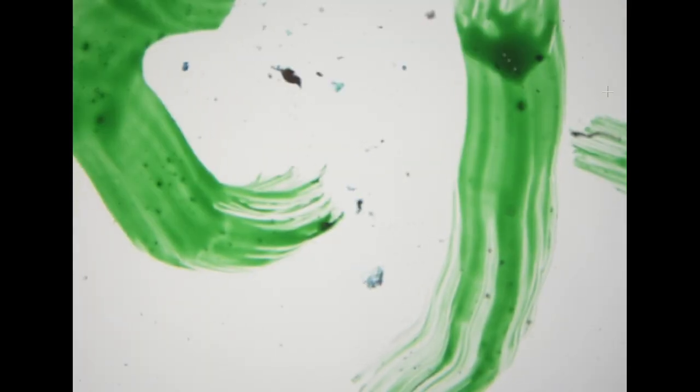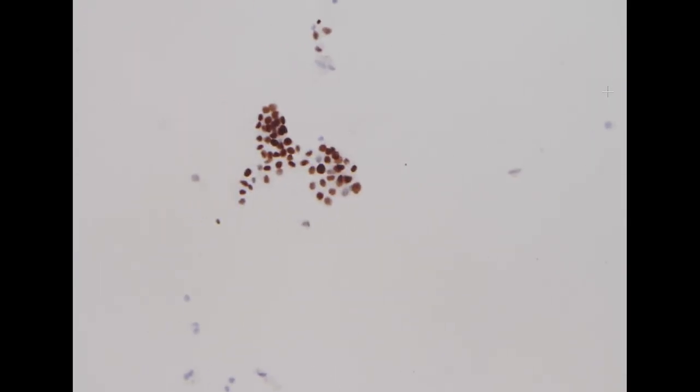The specimen was initially graded as benign inflammation by the cytotech. However, if we do TTF1, so this is a TTF1, you can see most of the cells, despite this very bland morphologic pattern, are diffusely positive for TTF1. So this is metastatic primary lung adenocarcinoma in the CSF specimen. It is not uncommon to see this very bland morphologic pattern in CSF metastasis.